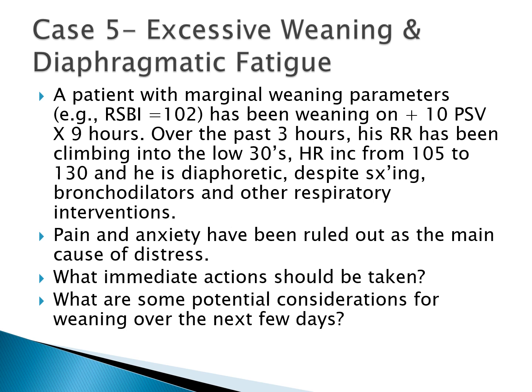What immediate action should be taken? This patient should probably be put back on full support. And what are some potential considerations for weaning over the next few days? Depending upon how hard you push them, you may find that some of these patients who weaned excessively on day one may take several days to recover. We can't understand, they weaned so well yesterday. Well, maybe they were pushed too hard. They developed diaphragmatic fatigue. You worked them too hard, and it's like a marathon runner. They trained for it, they ran the marathon, they did well in it, but now they need to take a couple of days off.